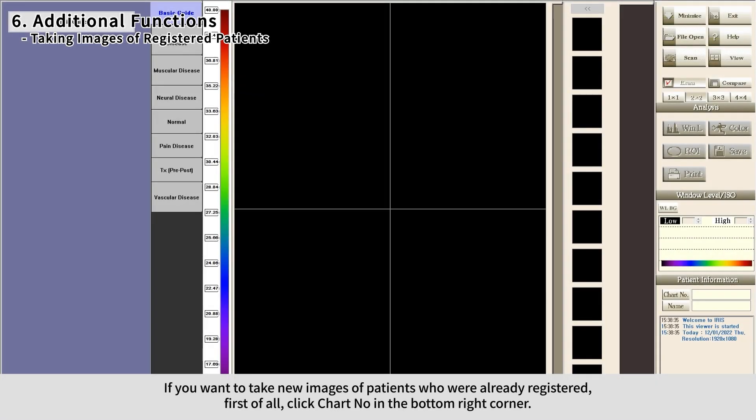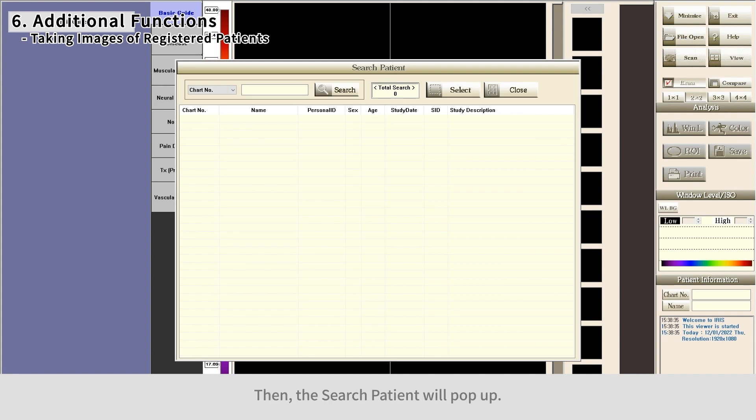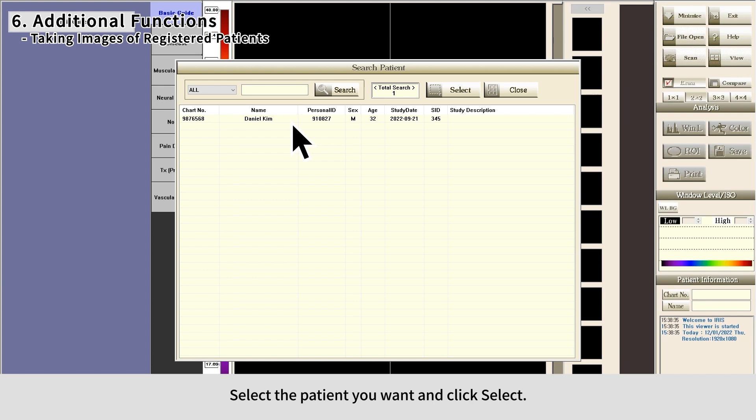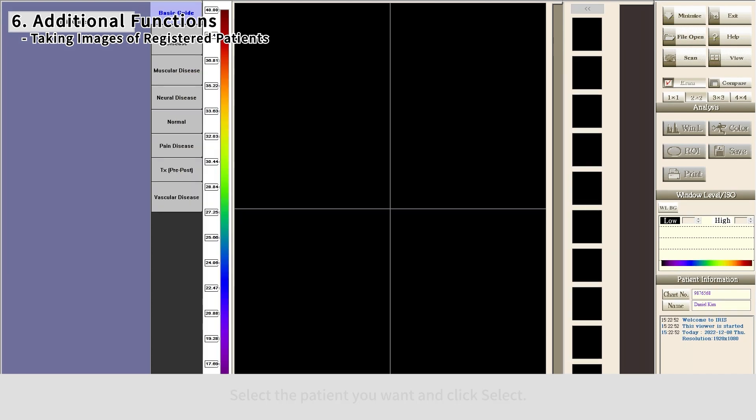To take new images of a patient who is already registered, click Chart Number in the bottom right corner. The Search Patient window will pop up. Select the category in the top left corner and click Search. Select the patient you want and click Select, then click Scan to take new images.